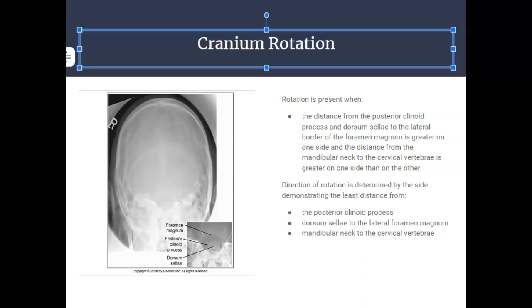Let's talk about cranium rotation in the Towne method. It is a little bit easier to detect because we are taking it as an AP projection. Head rotation is demonstrated on an AP axial projection if the distance from the posterior clinoid process and the dorsum sellae to the lateral border of the foramen magnum is greater on one side, and the distance from the mandibular neck to the cervical vertebra is greater on one side than the other.